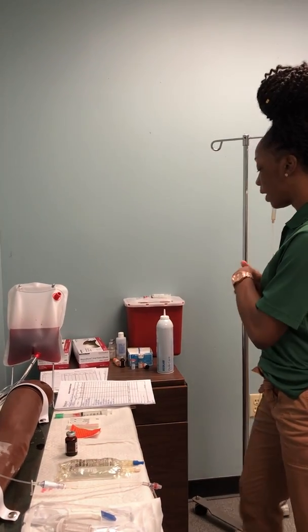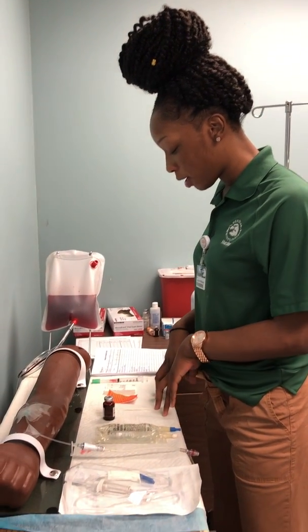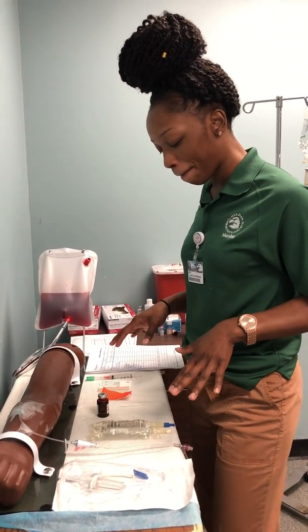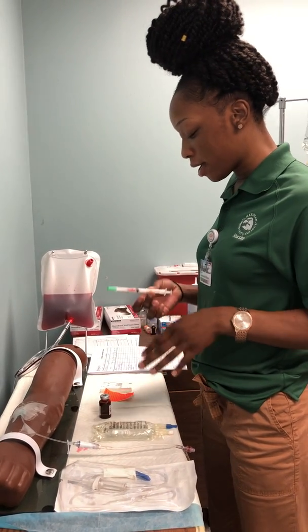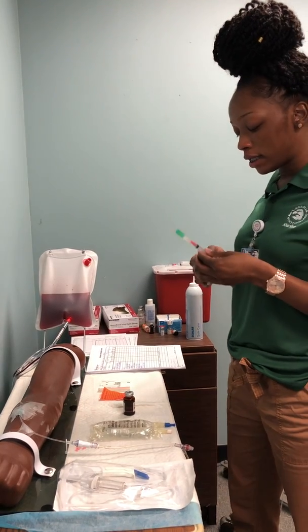And then I would wash my hands, and I've already gathered my medications and my syringe. I would start by drawing up the Lasix. I'm giving 3 milliliters of Lasix.